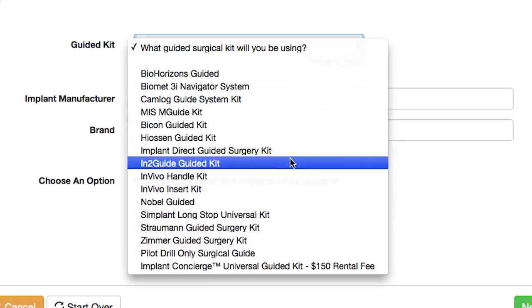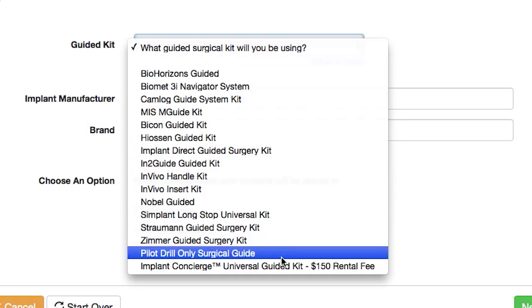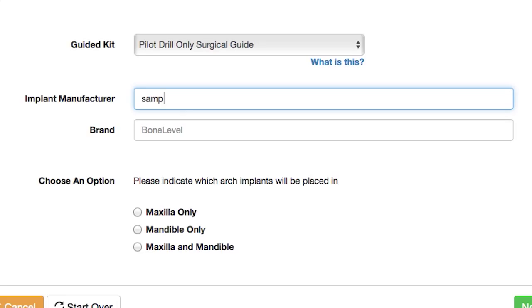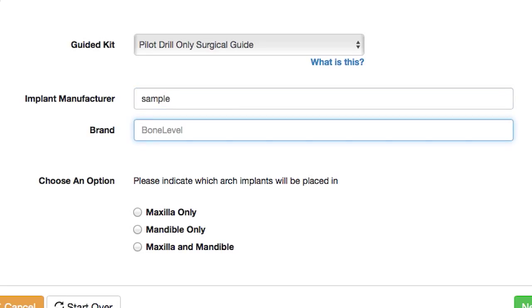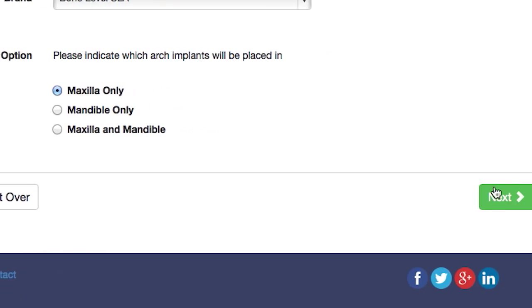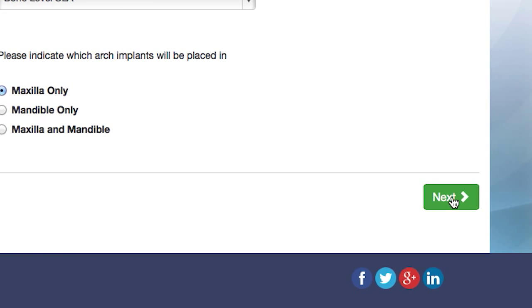If you do not own a guided kit, no problem. Select the Pilot Drill Only option and then complete the implant information. For this demo, we will be placing implants in the maxilla arch. Click Next.